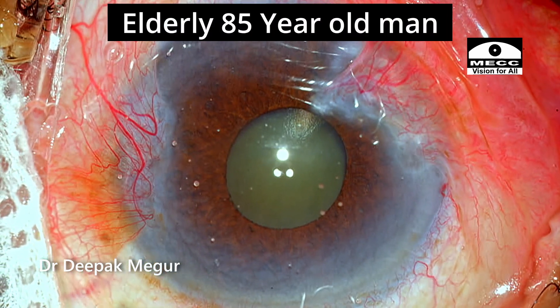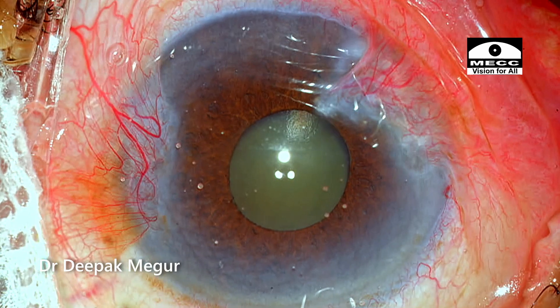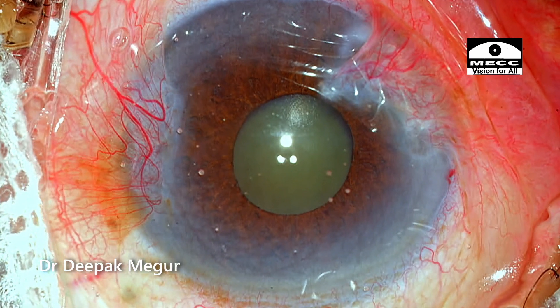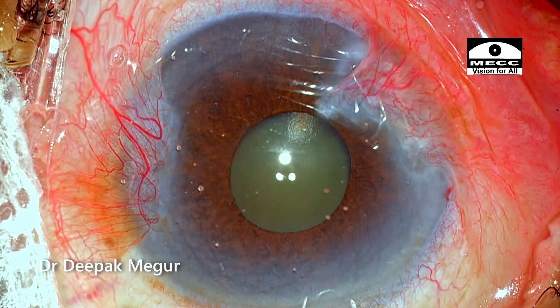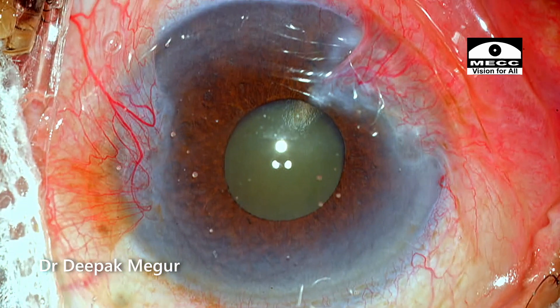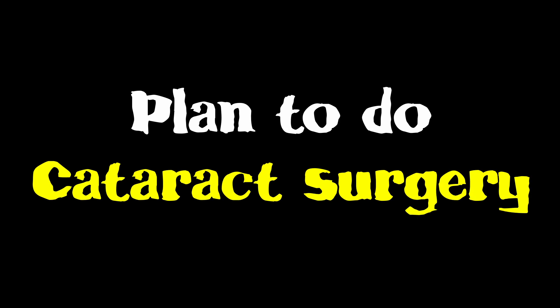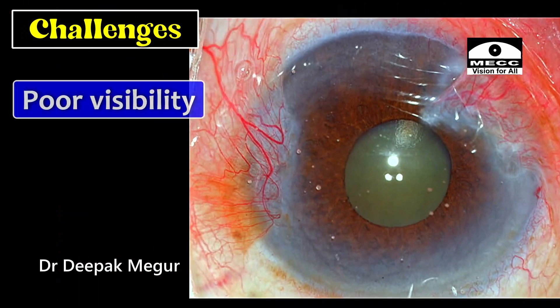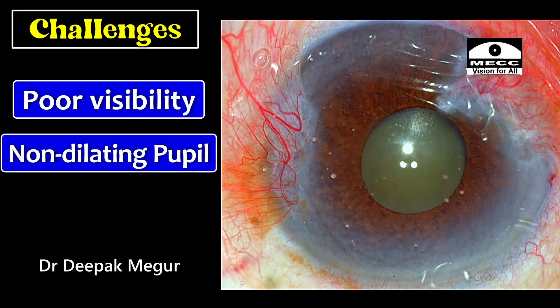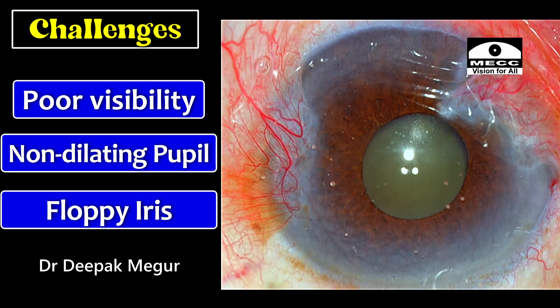He is an elderly man who is around 85 years old. General health is not so good. He is very hard of hearing. He has some urinary problems and is probably on anti-prostate drugs. The complexity is that he has a double-headed pterygium and a pupil which refuses to dilate. The patient is not willing for pterygium surgery and wants visual rehabilitation as early as possible, requesting cataract surgery before pterygium surgery. We plan the cataract surgery in this patient and these are the keratometry readings. The challenges include poor visibility due to the double-headed pterygium, a rigid pupil that is not dilating well, and I'm also expecting the iris to be floppy because he's been on anti-prostate drugs.